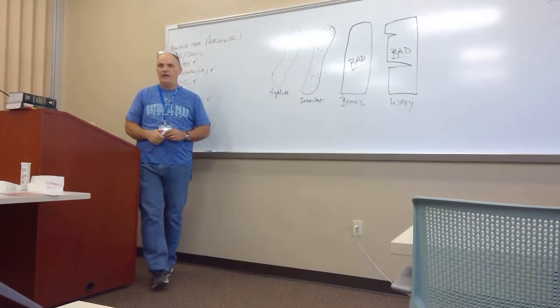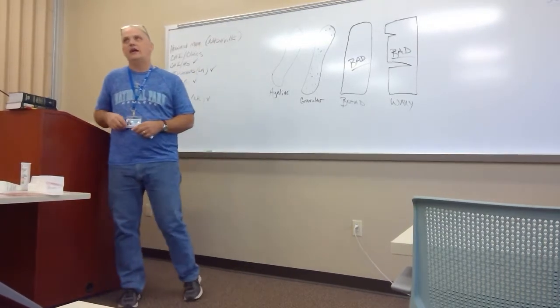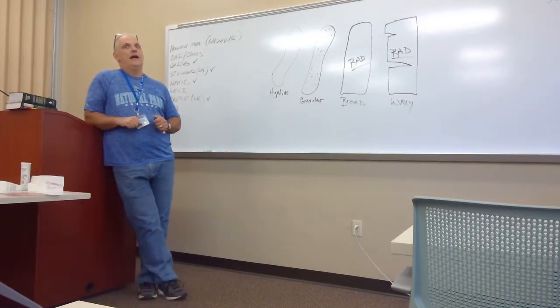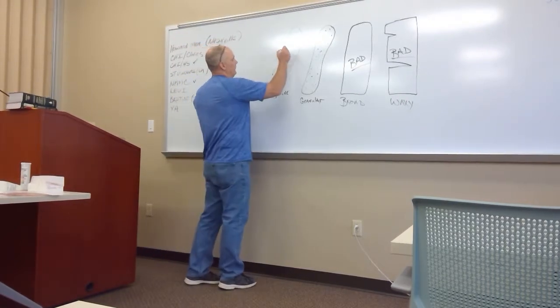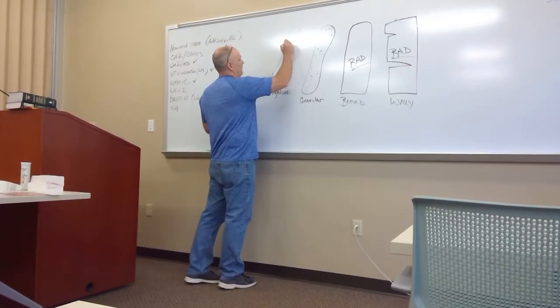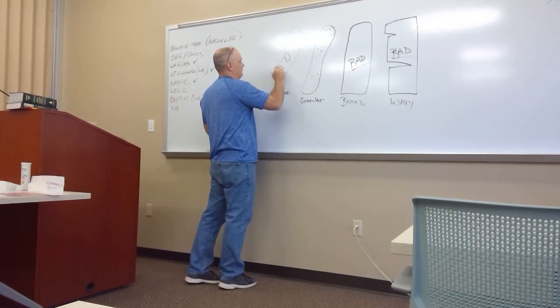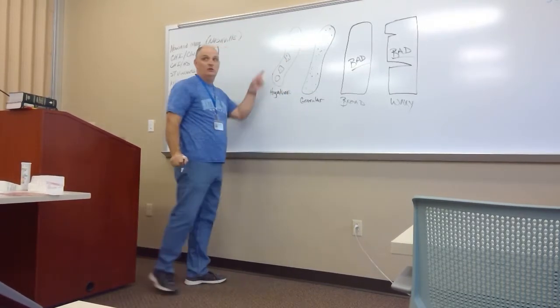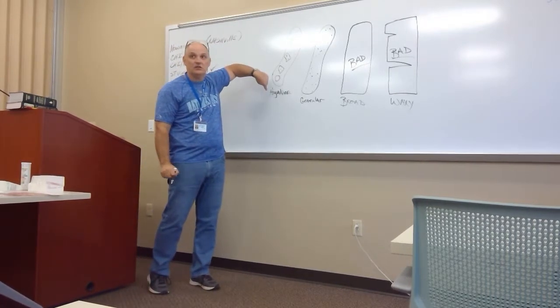Okay, everybody with me on that? So, for whatever reason, the book always talks about that. They love to ask that question at student bowl. How do you differentiate pyelonephritis from cystitis? And it's that you will see white blood cell casts in the urine sediment. So in other words, you'll see one of these that will have white blood cells trapped in it. With me? Even if you just see 4 or 5 of them, that would be considered a white blood cell cast.